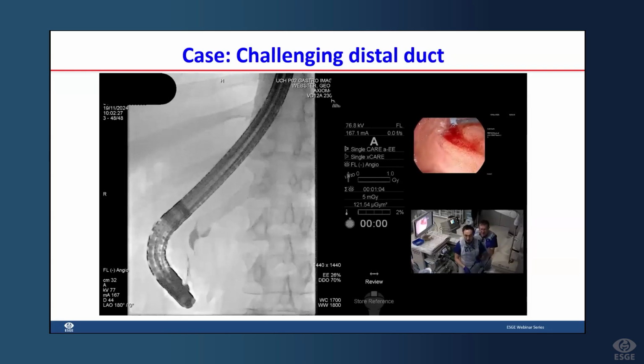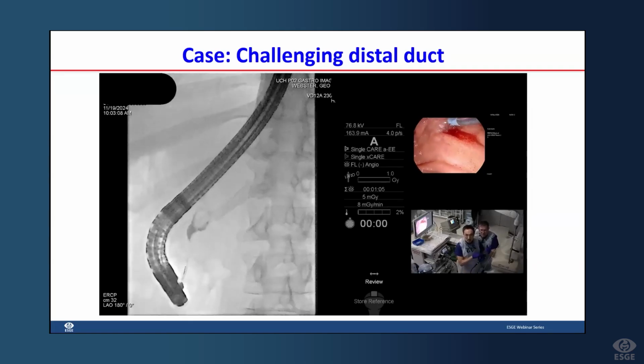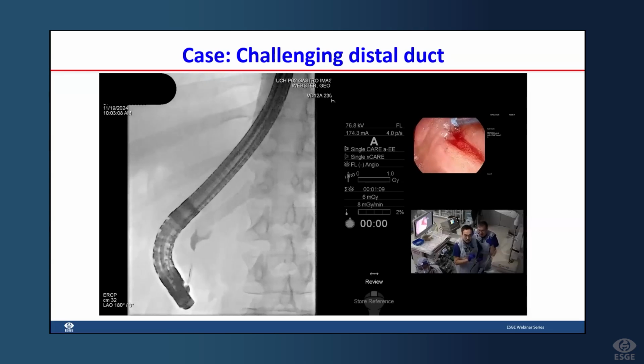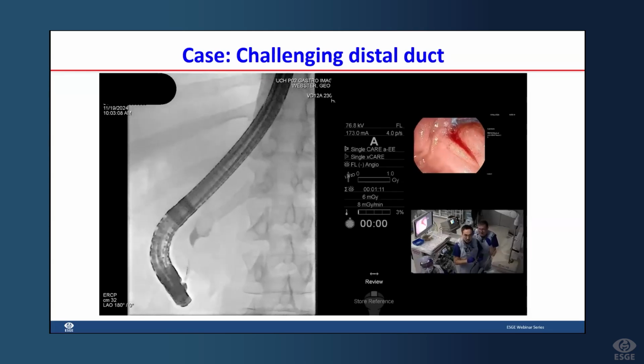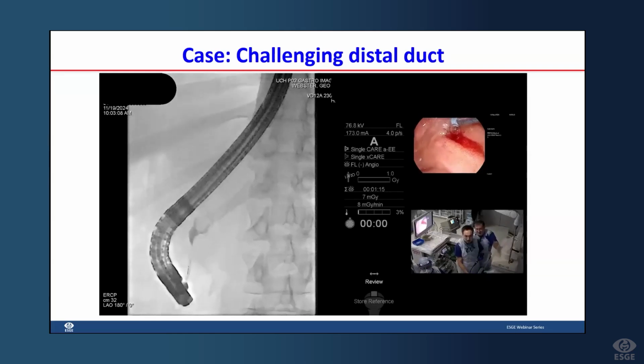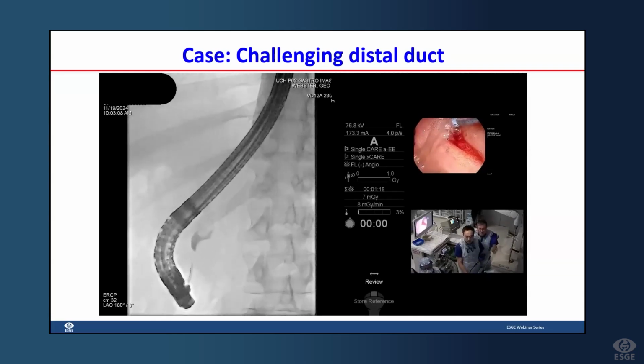So what you want to do here, and it's an active maneuver, because you can see that it's a sigmoid lower duct, is shorten your scope. So pull back your scope. Screen, please. Let's do this all in one. Let me just explain what you need to do, because there are different movements. You need to shorten your scope, drop your bridge, and take the bend off the sphincterotomy, because you need the wire to go flat and then come round. So let's do that. Stop screening.